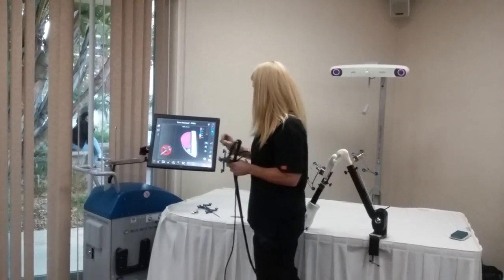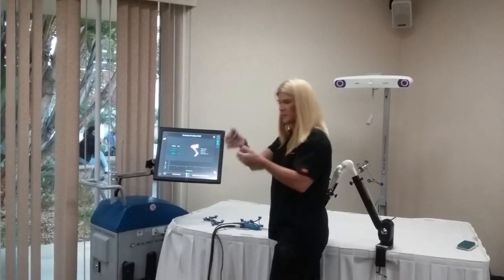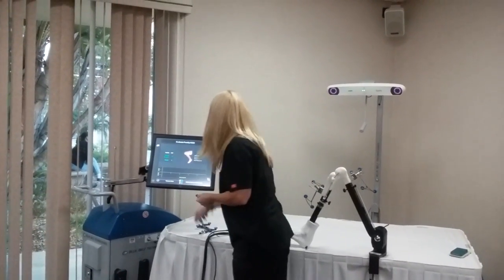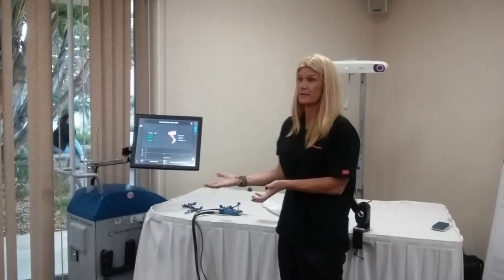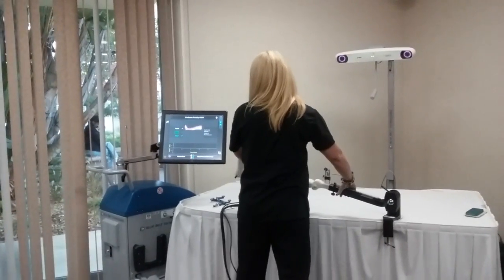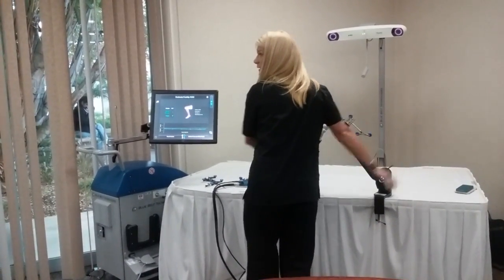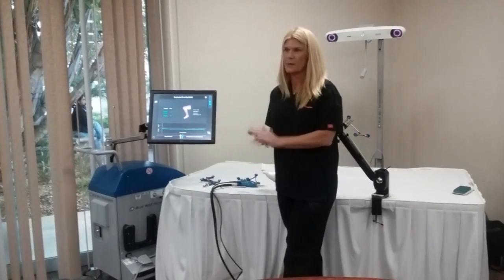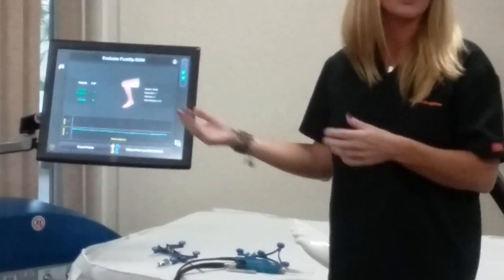So when he's done, everything's in. The tibia platform is in. He takes the leg through a range of motion to make sure that what we planned for is what we got. Essentially, once I take it through this graph, it should look perfectly like that when he's done. And that's when he says, okay, yep, I'm happy with the results. And that's where the accuracy comes in. So every time we plan, this is what we should get.